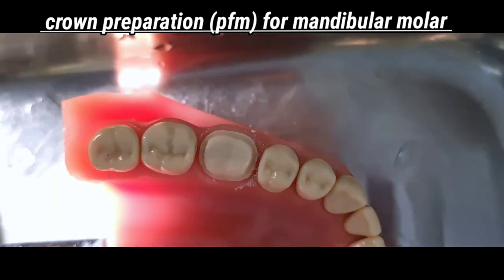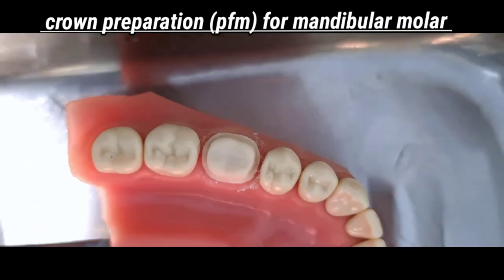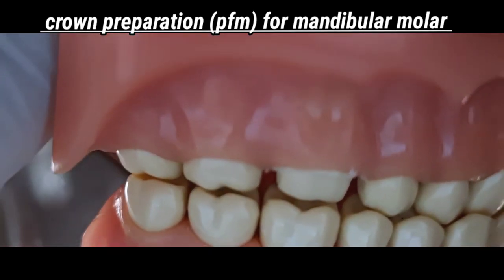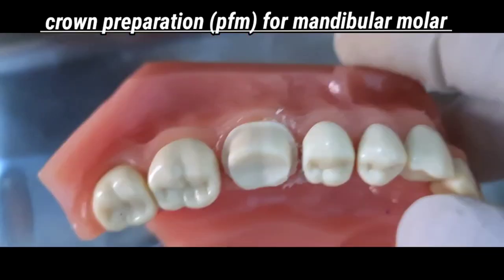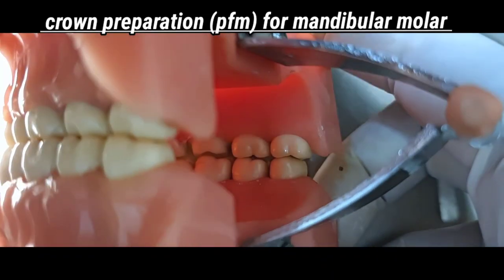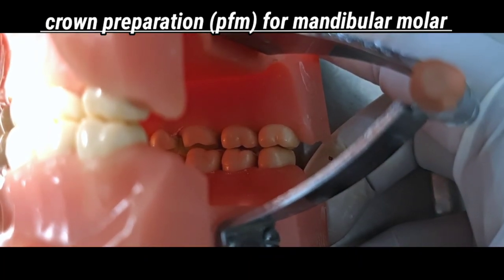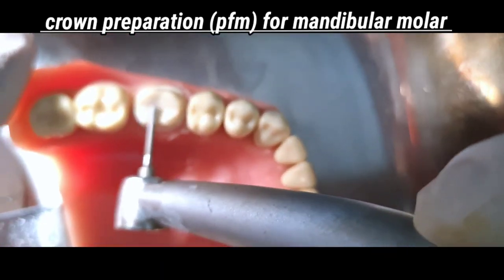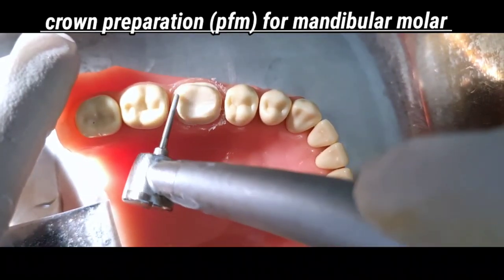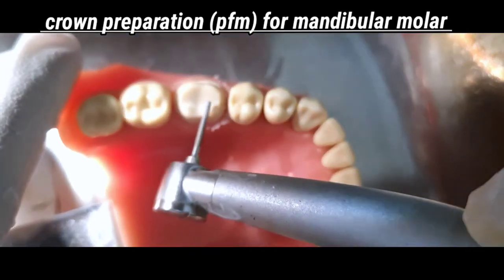Ensure there are no sharp line angles or point angles that remain in the preparation. Make sure you round off all the line or point angles, because this area could cause stress concentration and failure of the restoration. Check the occlusal clearance. And in the patient, palatal or lingual occlusal clearance you can check with the help of a mouth mirror. Finish the entire occlusal preparation. Make sure that cuspal anatomy is maintained. Round off all the line angles, and the point angles.